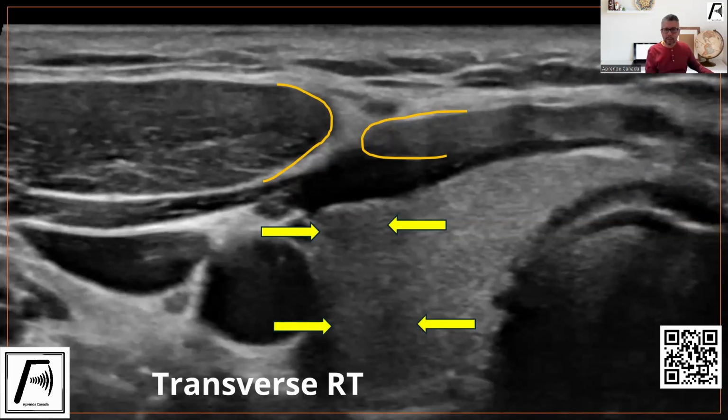Here you can also see that the shadow is affecting almost half of the thyroid lobe. Here you can see there's two muscles being delineated. But the point here is that the junction between these two muscles is falling on almost half of this right lobe of the thyroid. And so again, it makes it look abnormal. Again, perhaps not that it's a nodule, but it's an abnormal area.